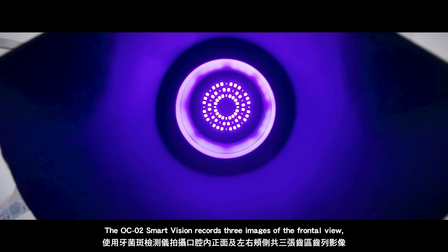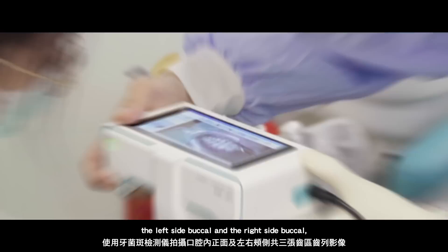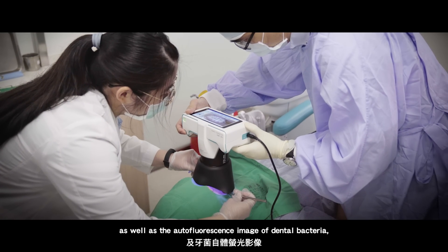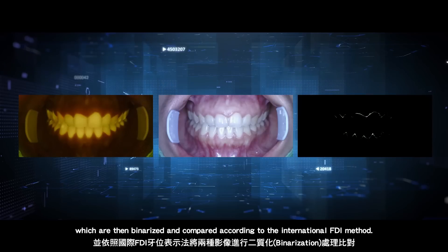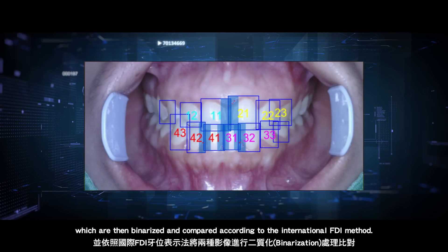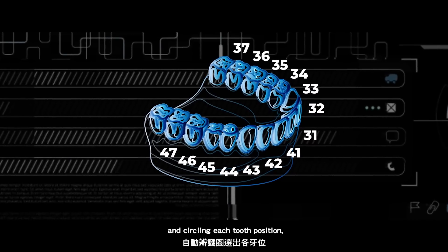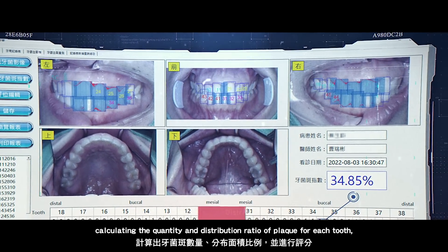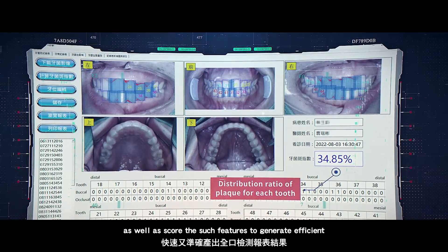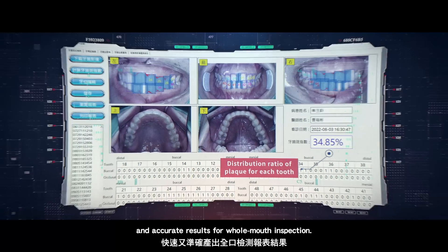The OC02 Smart Vision records three images of the frontal view, the left side buccal and the right side buccal, as well as the autofluorescence image of dental bacteria, which are then binarized and compared accordingly to the international FDI method, automatically recognizing features and circling each tooth position, calculating the quantity and distribution ratio of plaque for each tooth, and scoring such features to generate efficient and accurate results for the whole mouth inspection.